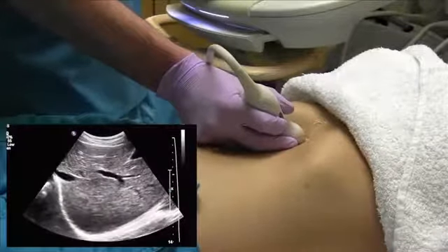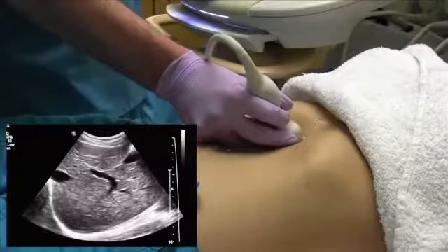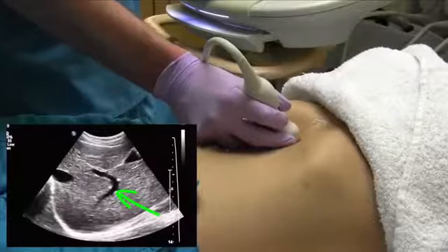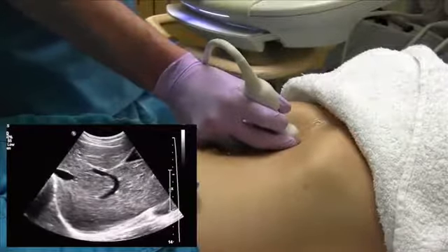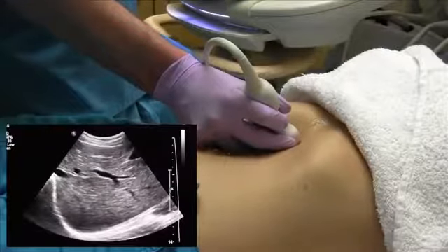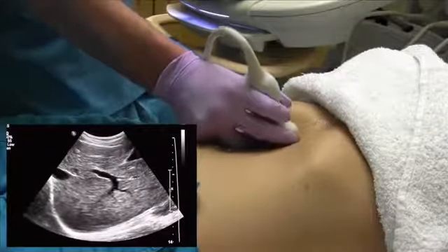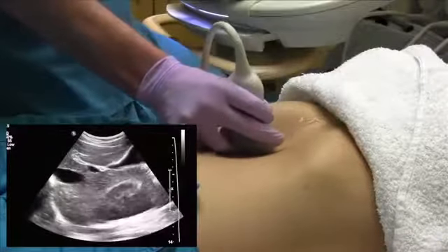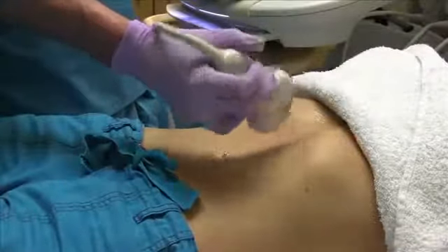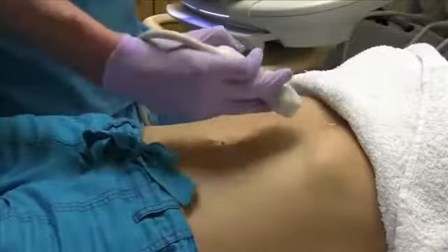The third picture of the right lobe you're going to take with the portal veins. If you were looking for any ductal dilatation, this is where you would see that, at the level of the portal system. And from there you just sweep all the way out of the liver. So that's the sagittal sweep through the liver.